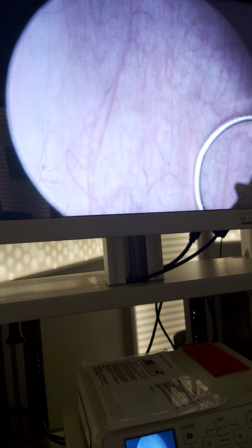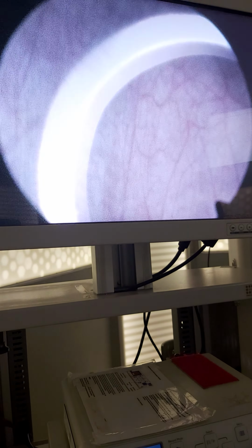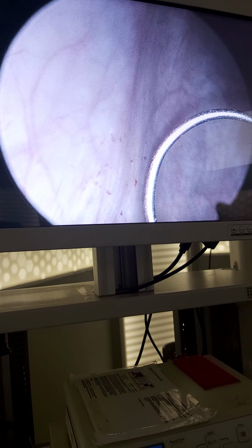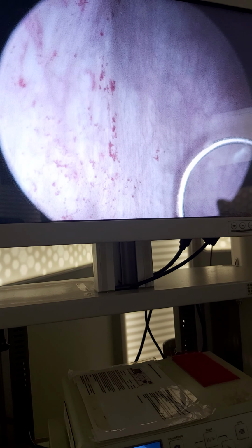Okay, I will make spots of fulgurations there. I am sure when I empty the bladder, these sites will begin to bleed. Now I will empty and see. This is what I see, what I mean with the fragile bladder. Now I am emptying and you see the bleeding begin. So this kind of bladders needs more time to heal completely. You see the bleedings here.